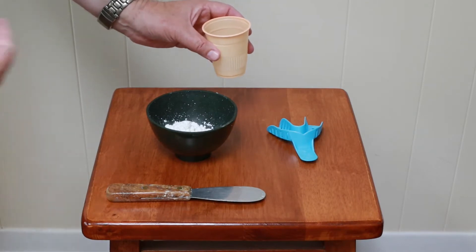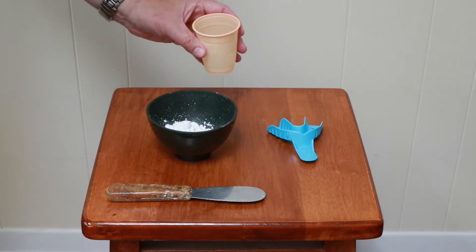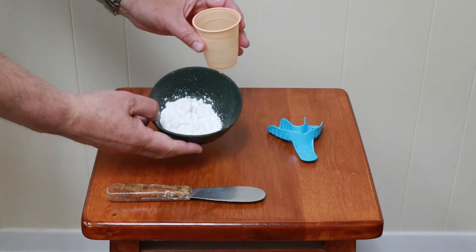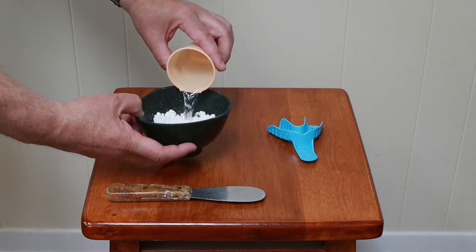And the reason I'm using a little bit less is so that the alginate will be a little bit thicker, a little firmer. It'll just make it easier to take the impression without it oozing all over my mouth. All right, so the first step, you have the powder in the bowl, and you add the water to it.